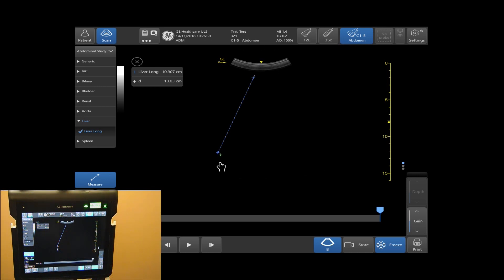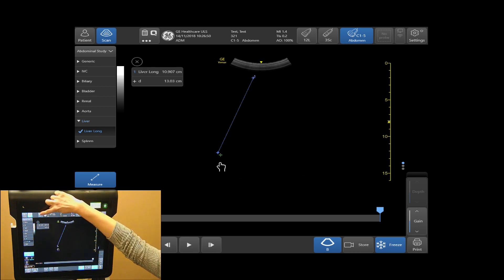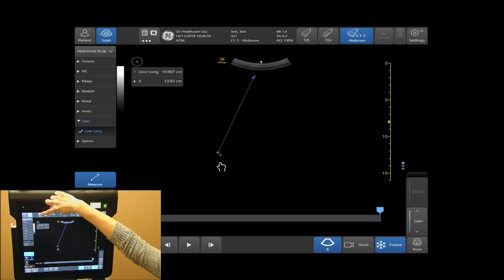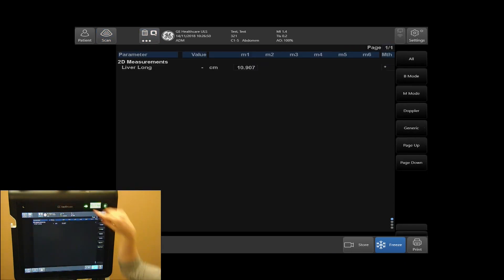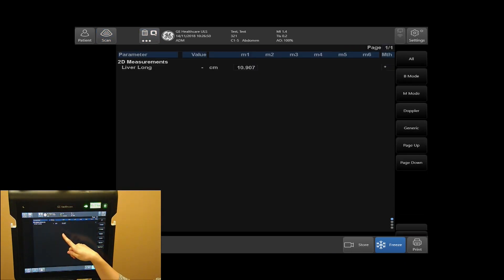To view your measurements taken in your worksheet, tap on your worksheet icon on the top of your screen. Select worksheet and all the measurements you have taken will be displayed.